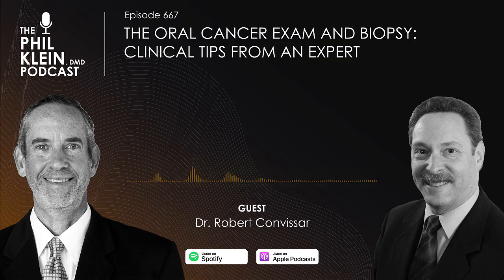You come back 2 weeks later to the patient and you're standing a foot closer to the patient. Well, it's going to look bigger. Or you're standing a foot further away from the patient. Well, it's going to look smaller. If you have a periodontal probe in the photo, you know that the size is exactly what it is. So that's a good little tip.